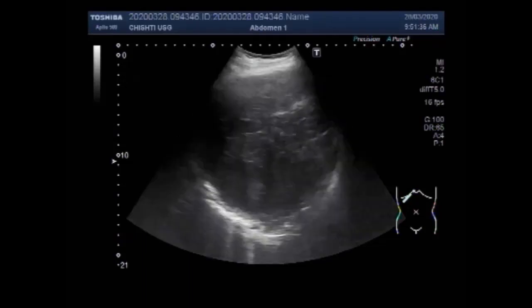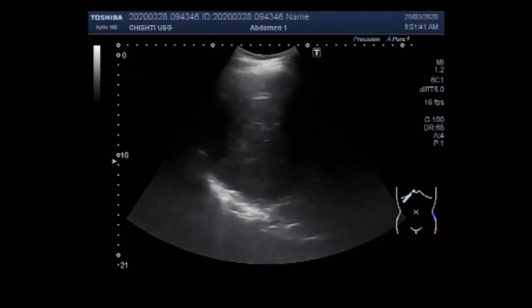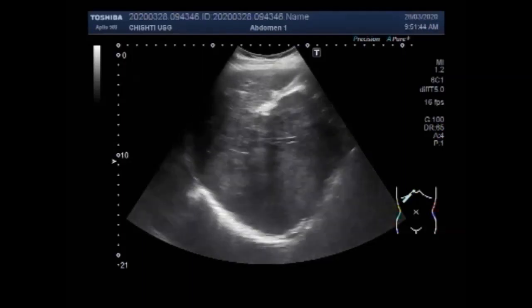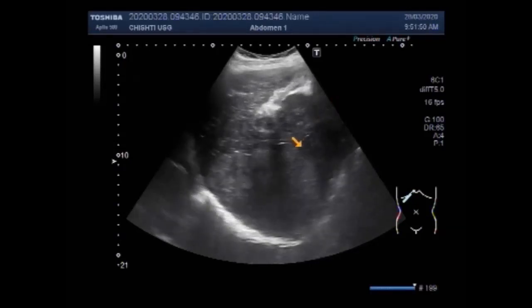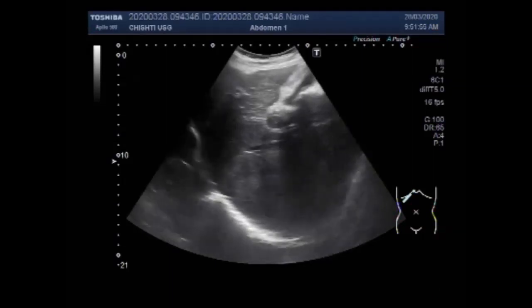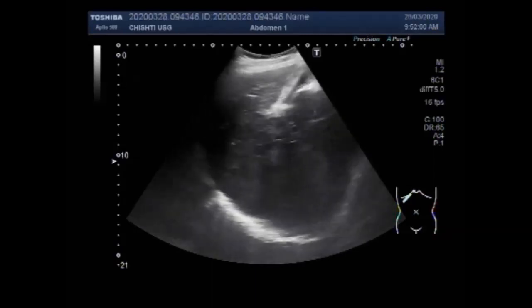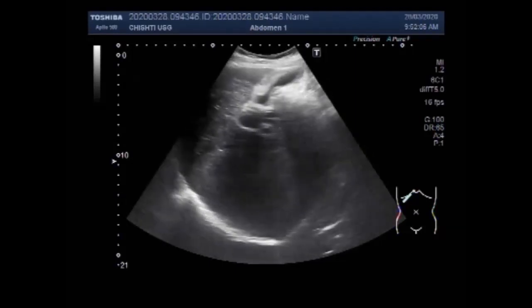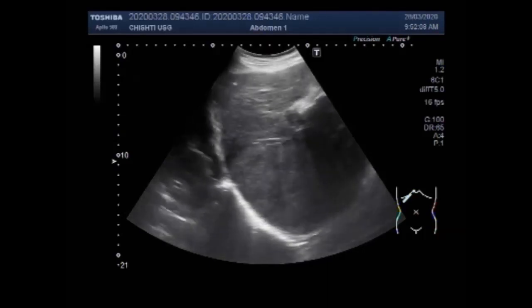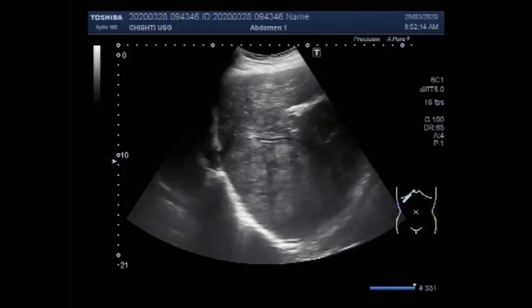You can see the liver, gallbladder, and a mass in the lower portion of the left lobe of the liver. So this is the mass. The mass is round to oval in shape, is semi-solid to solid in consistency, and has heterogeneous echogenicity.